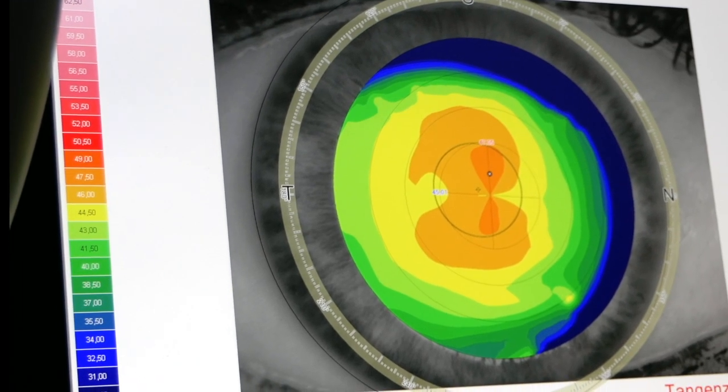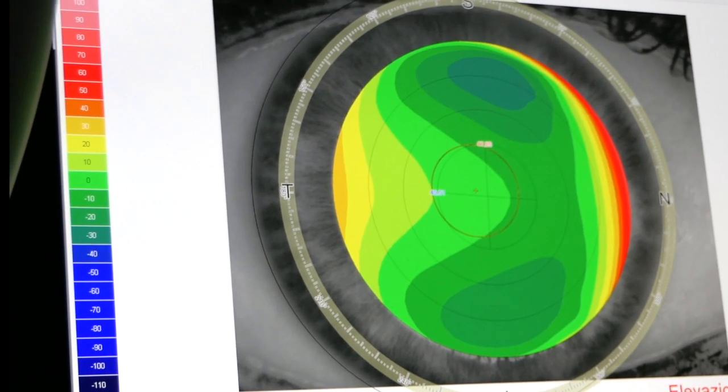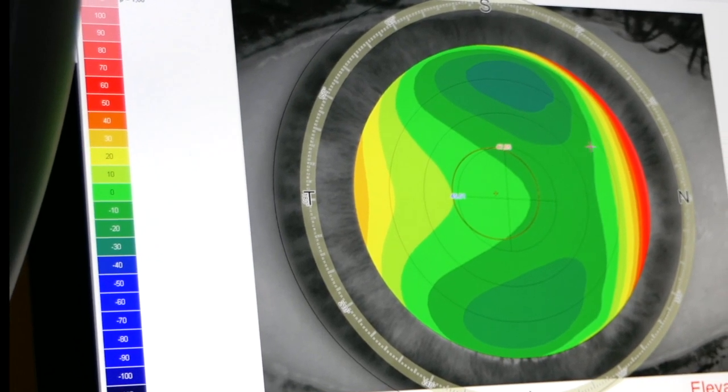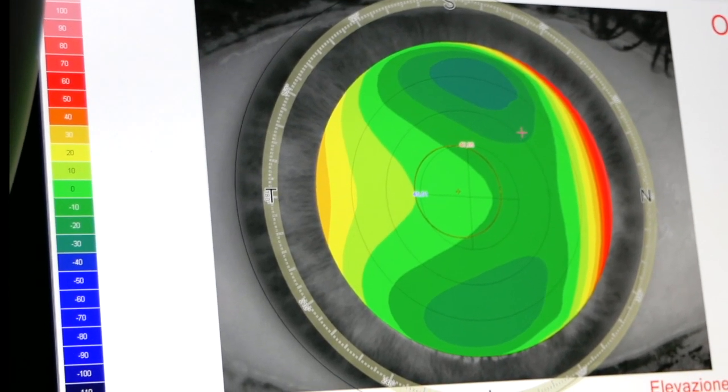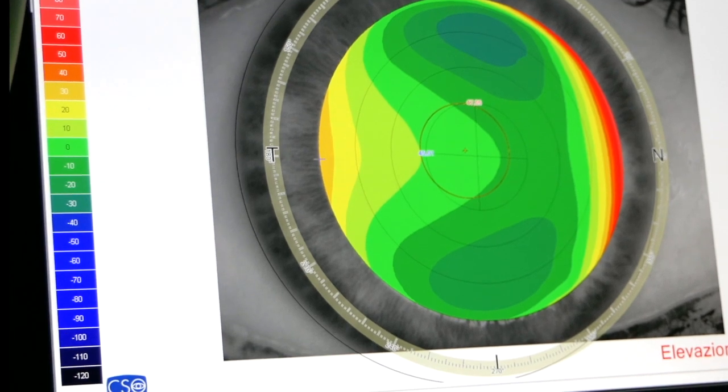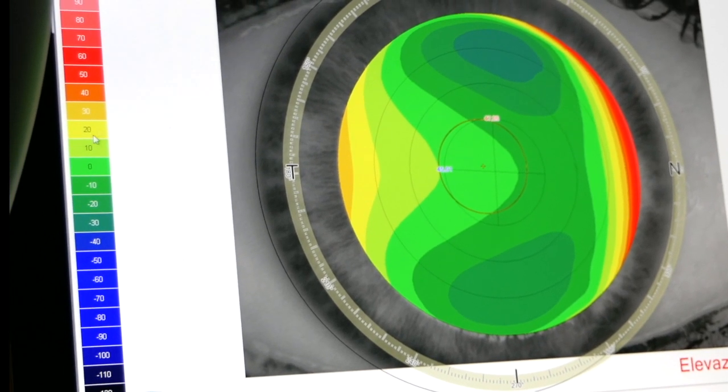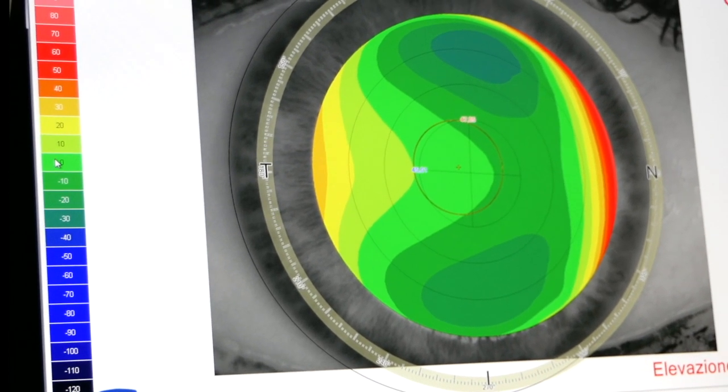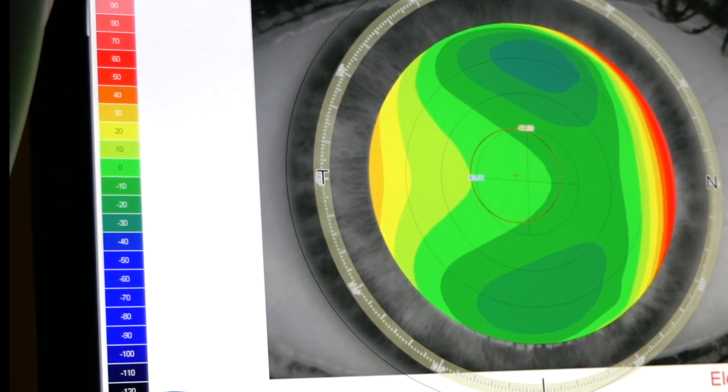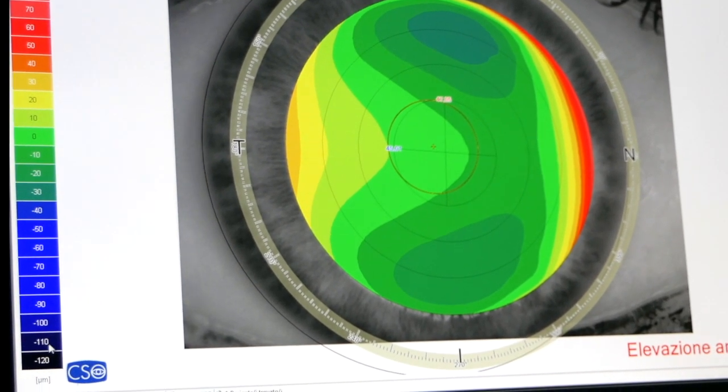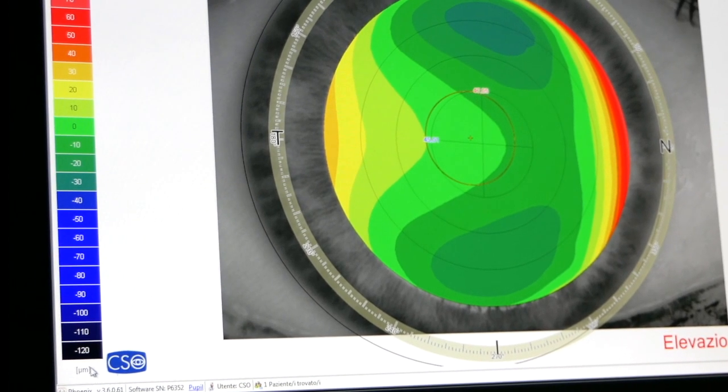In the same way, the machine can give us the front elevation, which is a more difficult concept. Now the scale is zero green, then the red is plus and blue is minus expressed in microns.